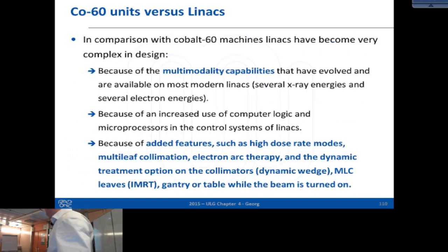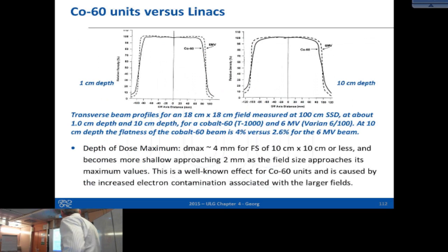And then this is something that is not so important. Here again you see the different influence of the cobalt and the LINAC source dimension, and also for performing IMRT and highly sophisticated precision treatments, you want to have a steep dose gradient between your organ at risk and your target, and that's why we assume we want to have a very steep penumbra. Is that really true? Do we want it or do we have it? We have it. But is it always really good? No, I mean it can be good.